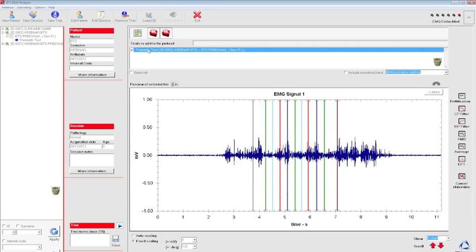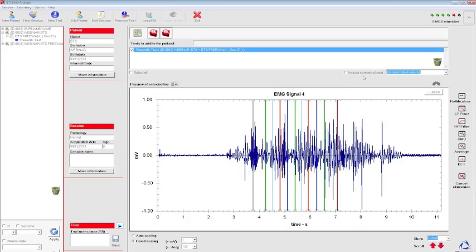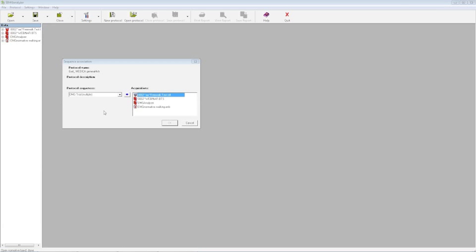As usual, here we will detect the same EMG signal that we just saw. So here there are all the instants detected. We select to include the normative band for the walking, and we choose this protocol that is BTS FREEWALK 4 channel. Okay, I don't think that you see the screen. You should now. Okay, perfect. We make the association between the trial, the information of the patient, the normative bands that we just selected, and the images needed for the report, and we click OK.